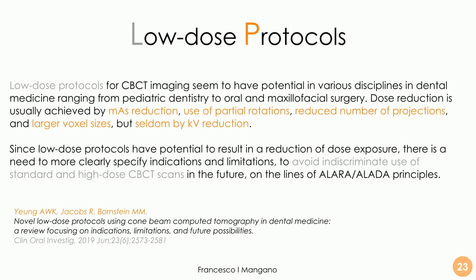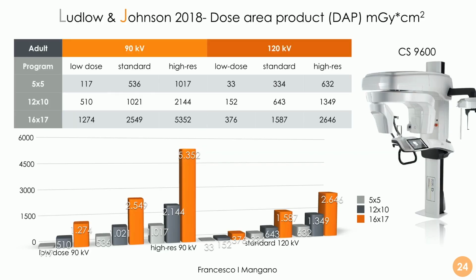So it is possible, for example, for diagnostic purposes, that it does not affect the diagnostic capability when we use some low-dose protocols, and low-dose protocols are also currently under investigation for other applications, such as, for example, guided implant surgery.